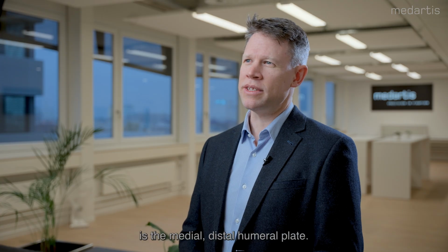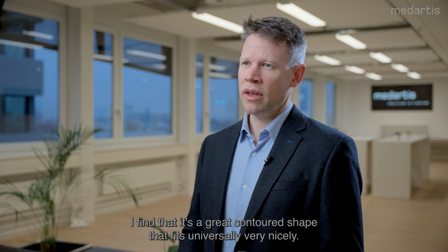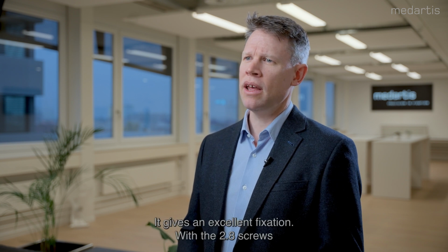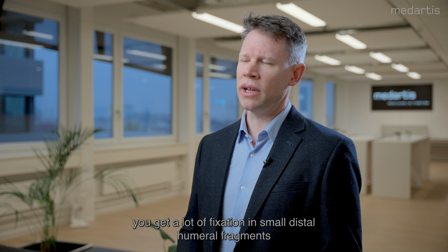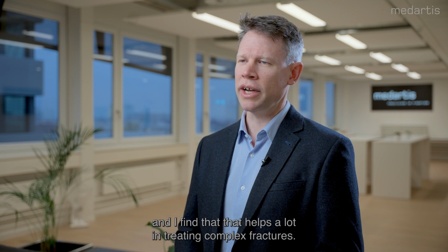So my favourite plate is the medial distal humeral plate. I find that it's a great contoured shape. It fits universally very nicely. It gives excellent fixation. With the 2.8 screws, you get a lot of fixation in small distal humeral fragments, and I find that that helps a lot in treating complex fractures.